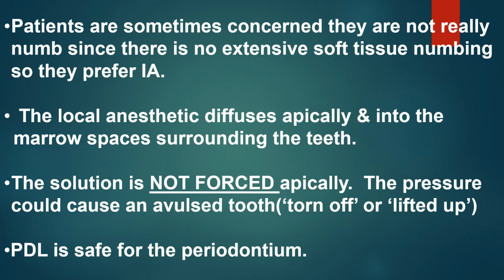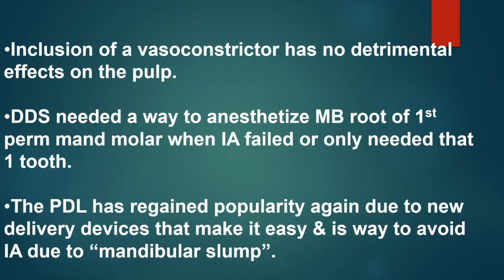But the PDL is very safe for the whole periodontium. You can include a vasoconstrictor. It has no bad effect at all on the pulp, like it did with another of the supplemental injections, but it does not on this one.